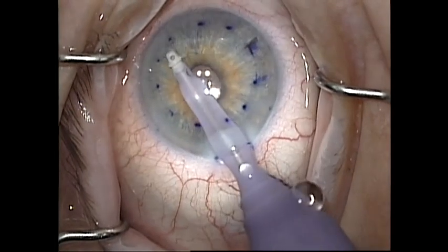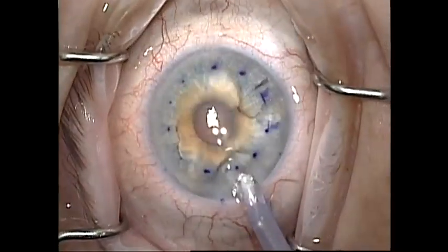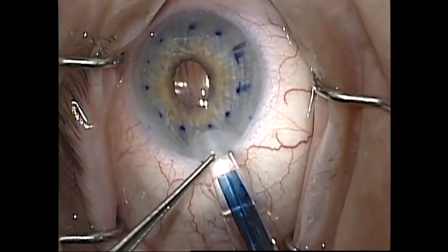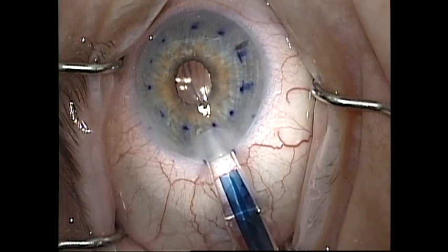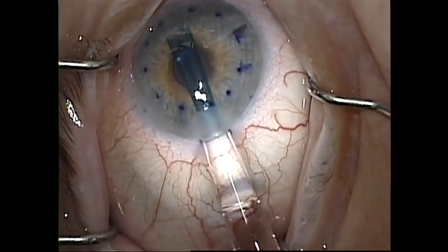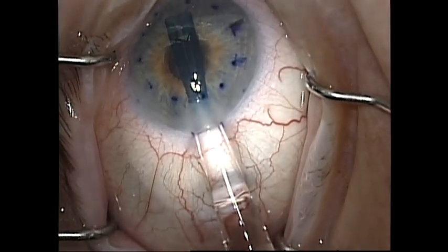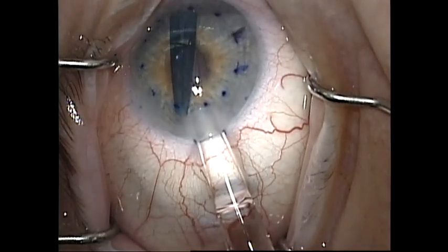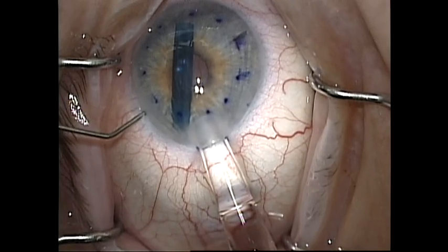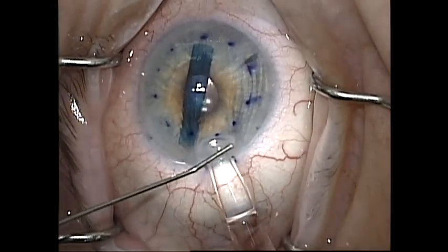Prior to injecting the graft, I inject Miochol to constrict the pupil and do one more round of irrigation and aspiration to remove any viscoelastic or fibrin from the anterior chamber. When injecting the graft, it is very important to take your time and use very fine, controlled movements to gently irrigate the graft into the anterior chamber. If at any time the anterior chamber is becoming over-pressurized, it is important to decrease pressure through a paracentesis. Failure to do so can result in ejection of the graft.